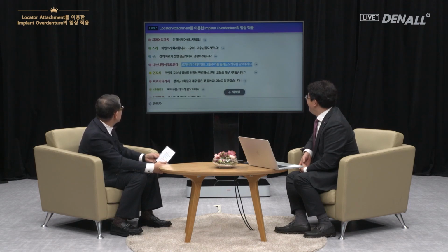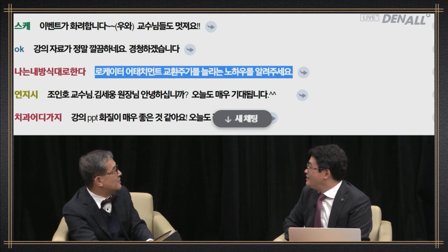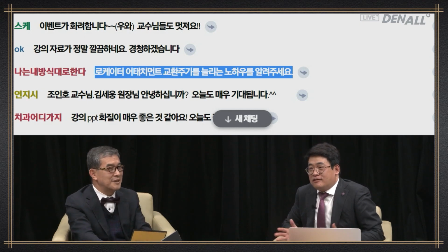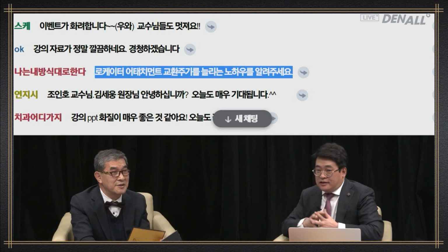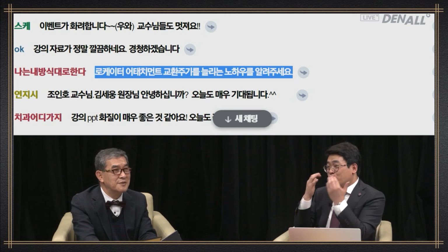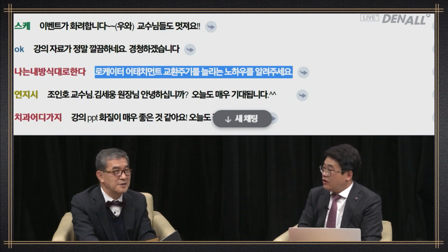Amongst the questions, I do it my own way. I think this person has a very strong opinion. How can I extend the cycle of replacing locator attachments? I think the person is asking how I can use the nylon part long. When the patient puts on a denture, they should use their hands and put it in. That is ideal. However, most patients put it in like this, especially female patients. They put it in and they bite it and they put it in, and this can lead to deformation. Maybe they're not as good with their hands.